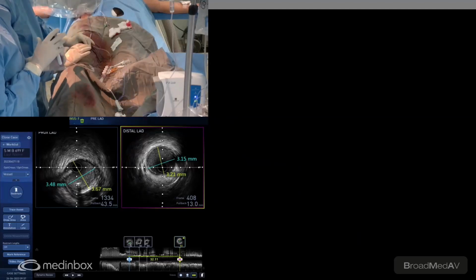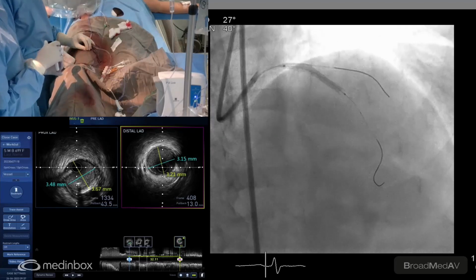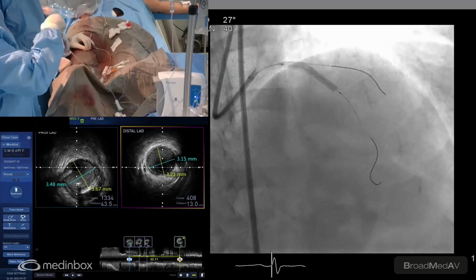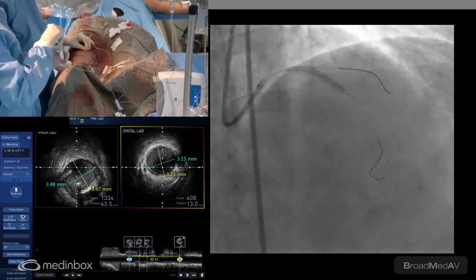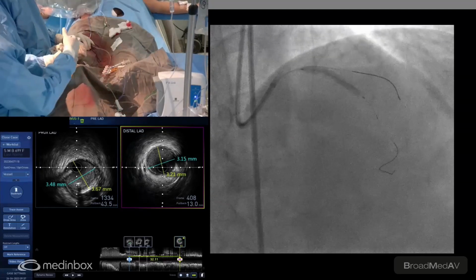So you can see that the stent has uniformly come up after the debulking with no issues. Yeah, deflate and go up once more. With these long lesions, it's better to do a couple of dilatations of the stent so that we can get a good result. Deflate, please.